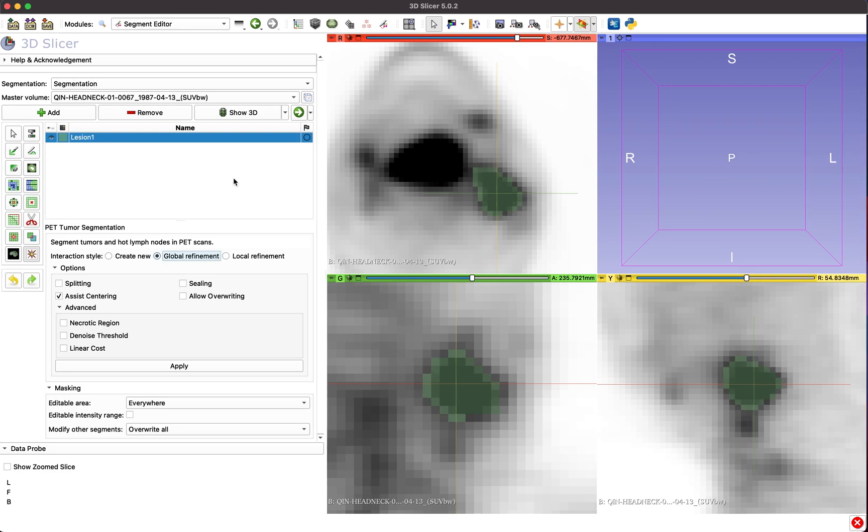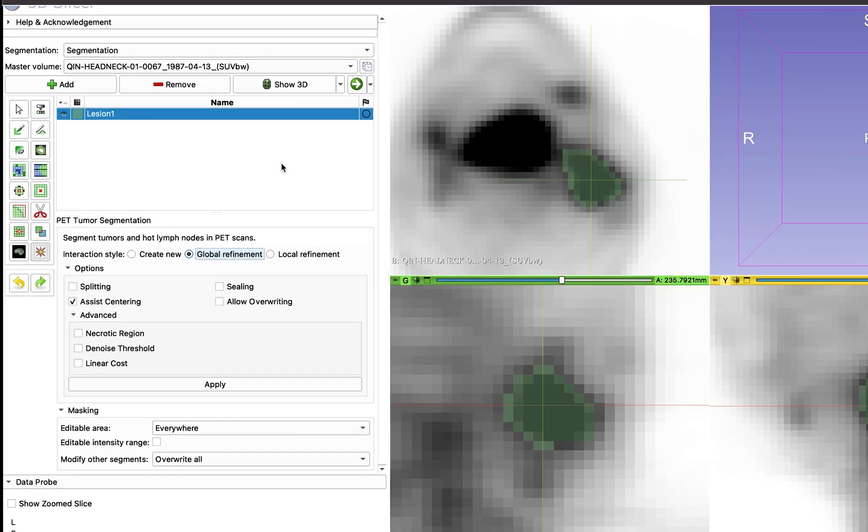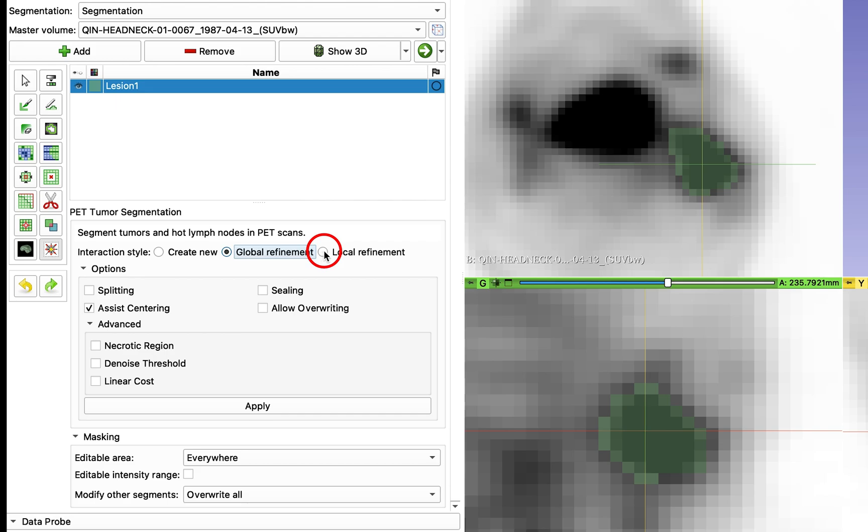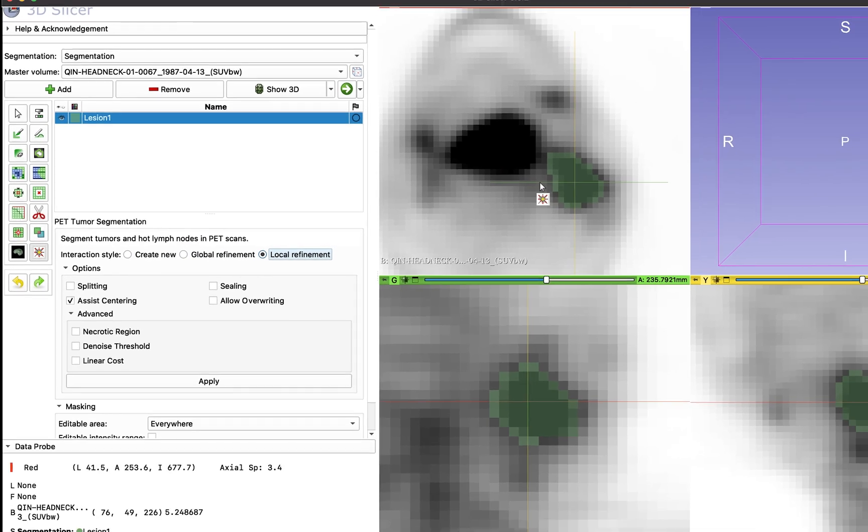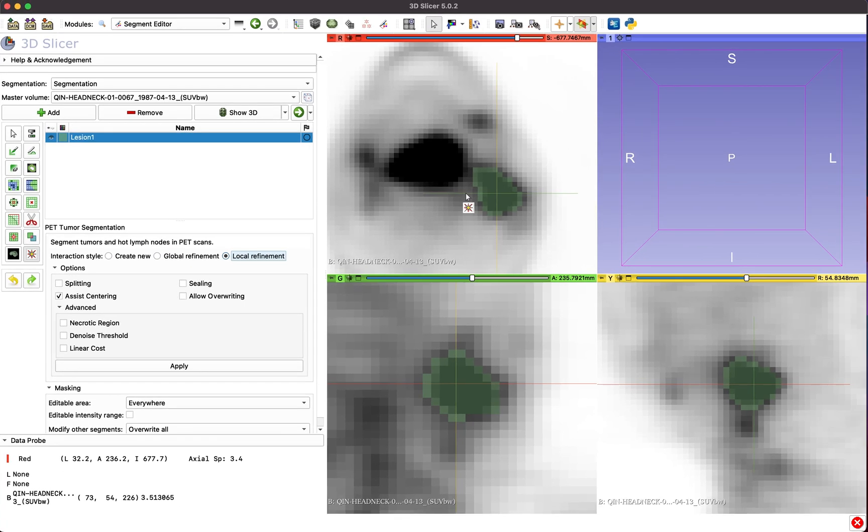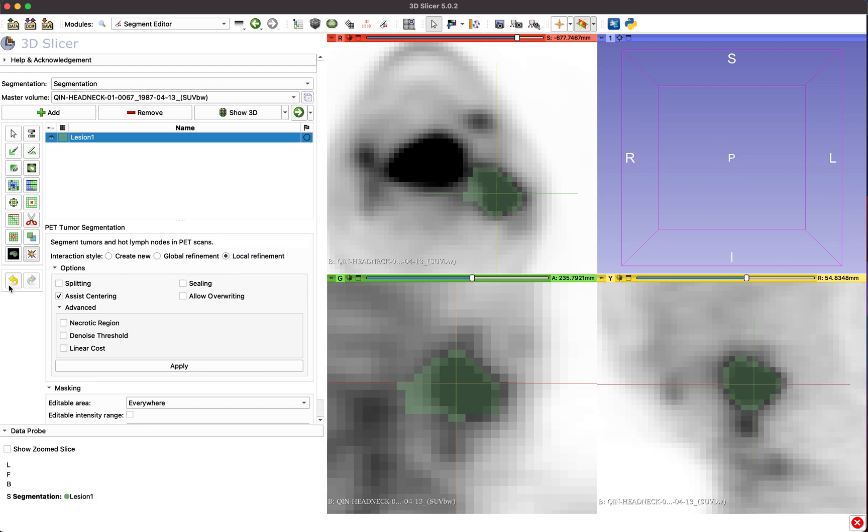In cases where most of the segmentation appears correct, but there are local segmentation errors, select Local Refinement and click on a point the new boundary should go through. This changes the boundary of the segmentation only in the area near the segmentation error.